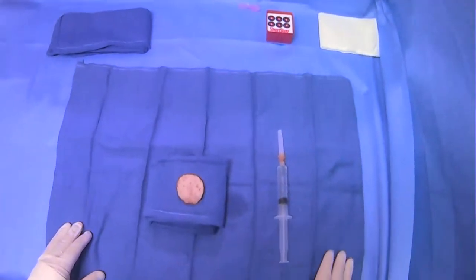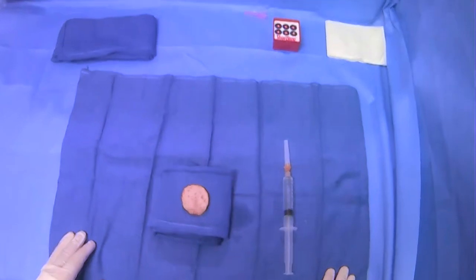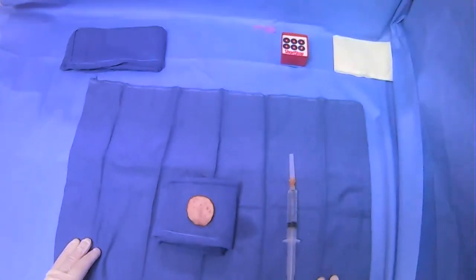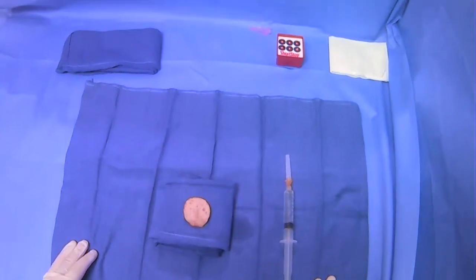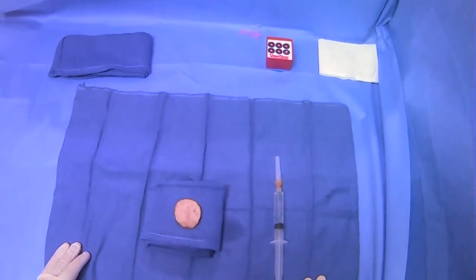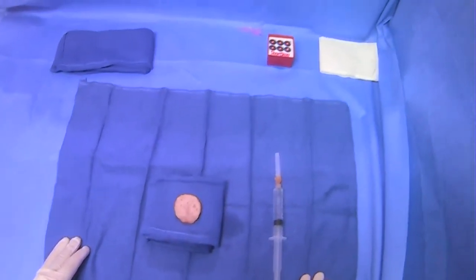We're going to discuss how to properly administer lidocaine to the skin to anesthetize locally for procedures. This is oftentimes one of the first things you will do for the patient, and it will be the first time you puncture the skin.